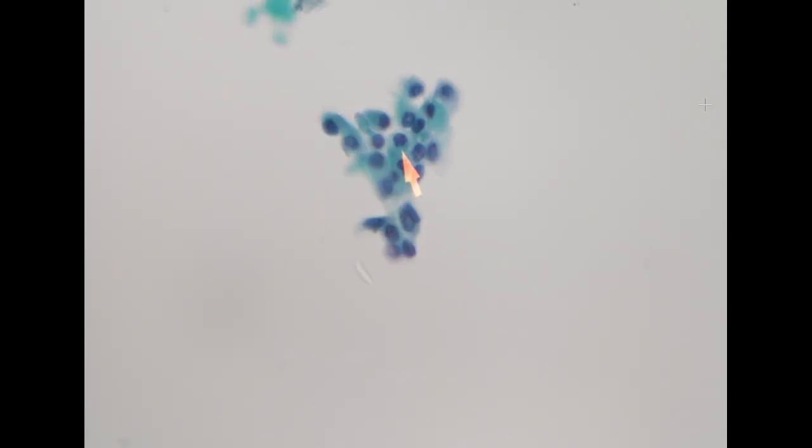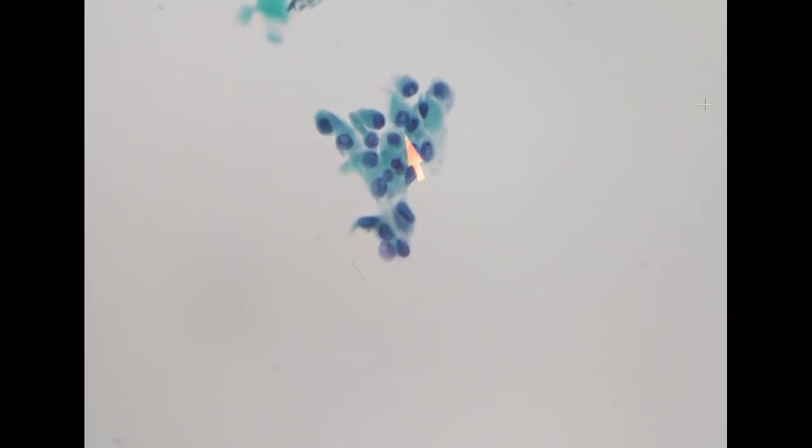So on low power, it can be compatible with benign follicular nodular disease. However, when we go to high power, we see most of these follicular cells have nuclear features of papillary thyroid carcinoma, and you can see that the pseudoinclusion is very apparent in these cell clusters.